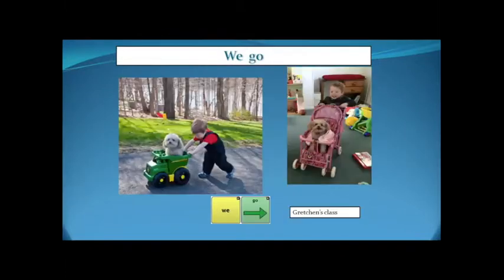We sleep. We go. There's a teacher, excuse me, Gretchen Storm. She's an SLP, and she works in Colorado, in Littleton School District. She was one of our guest speakers on one of our webinars that is recorded and on our website. I can show you how to go find that. What she does has been really amazing, and most of her device users in this elementary school are actually reading with their peers in the regular classroom. And the way she's done that is really from making all these books.